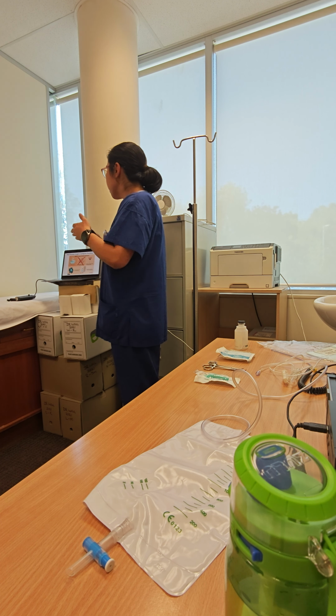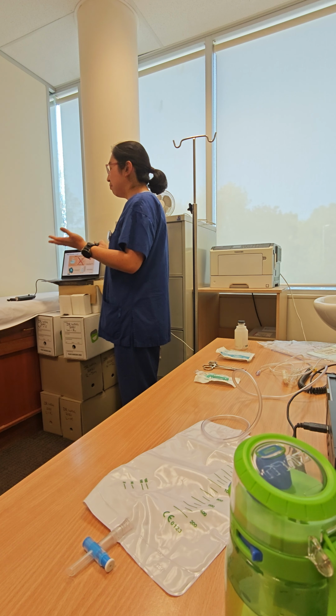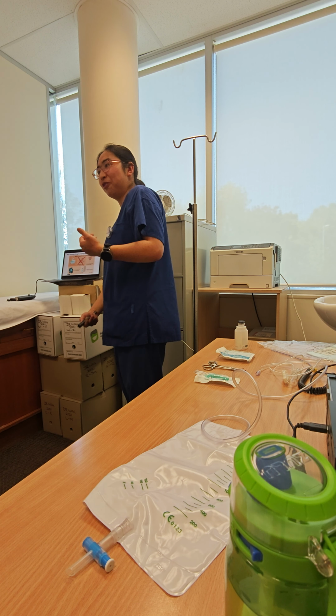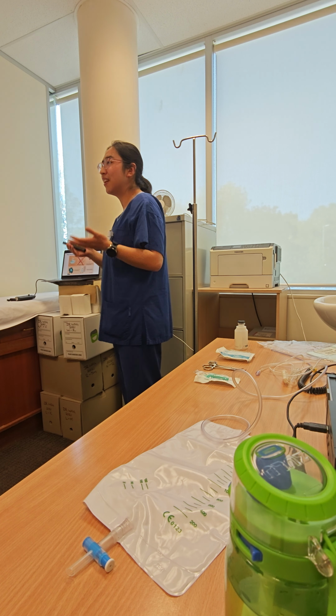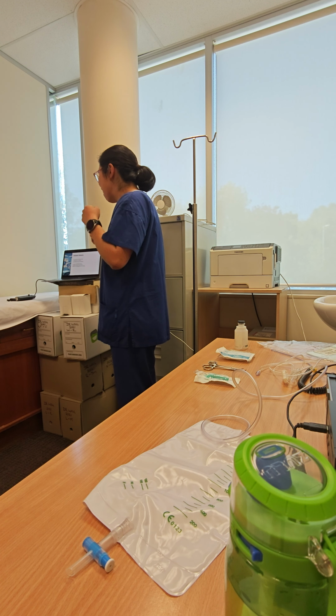For our post-prostate surgery cystogram, it's even simpler because they have finished the surgery and the catheter is already in their body, so we don't have to do that. But actually, is it that simple? Let's have a look at our case study.